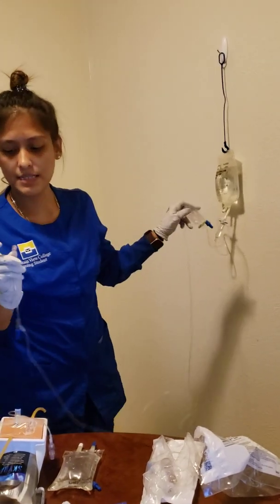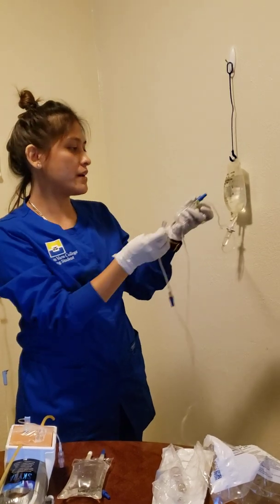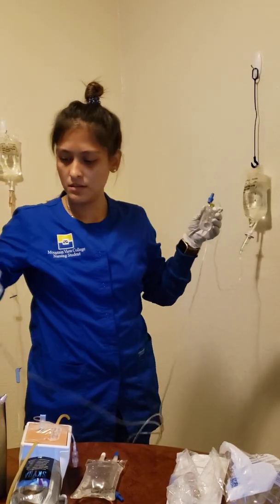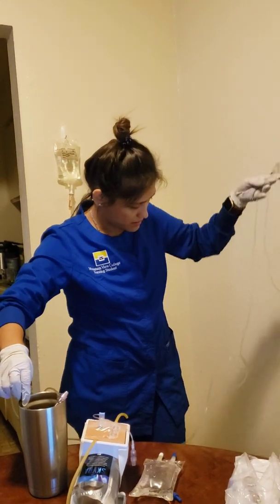Again, like I said, this is brand new, so I'm taking my top off here, and I'm going to squeeze and make sure I get all the bubbles out of there.